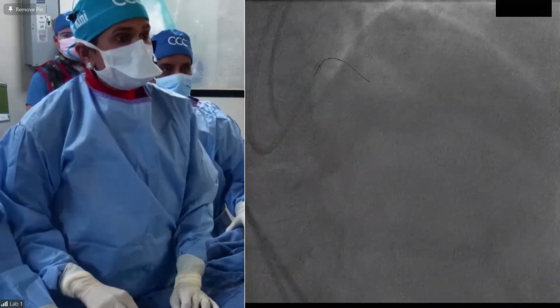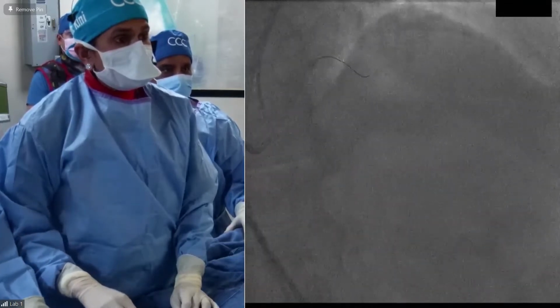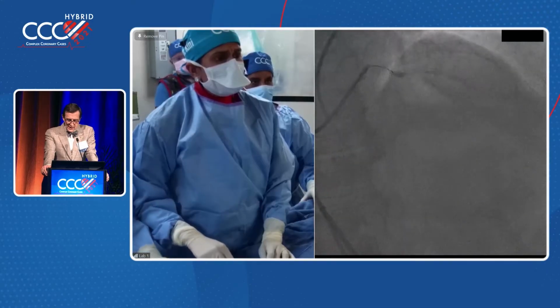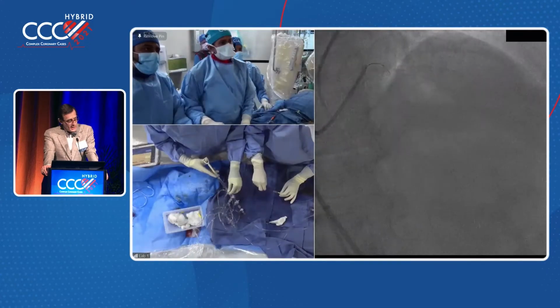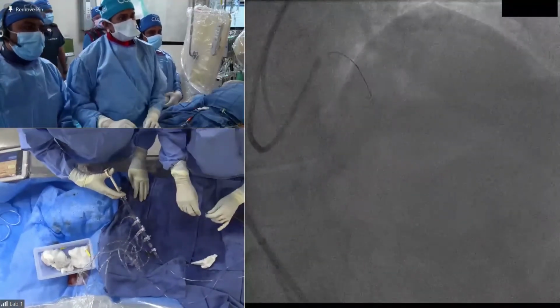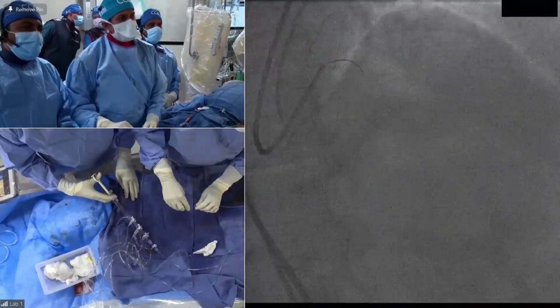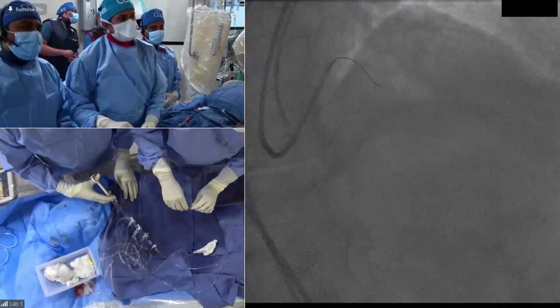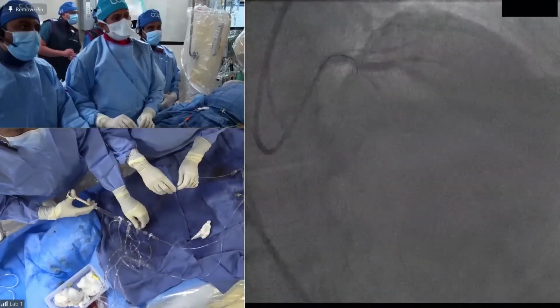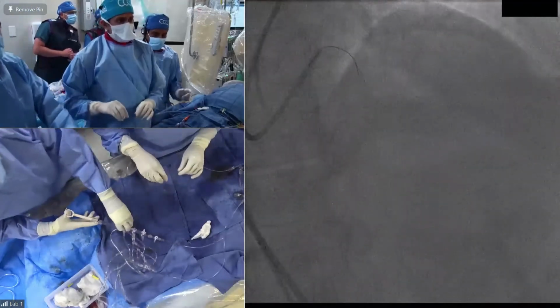Okay, well, let's see. It's a very challenging case. We have to go with the wire first, find the mouth of the occlusion, and then try to do some escalation. There are many branches up top, and then have to navigate through those. And obviously, a microcatheter is a must. Is there any specific preference from the panel for microcatheter? Anybody have a very strong opinion for one versus another microcatheter?